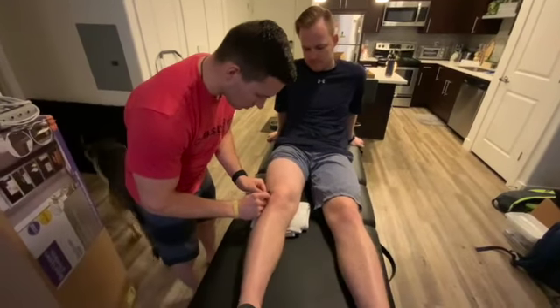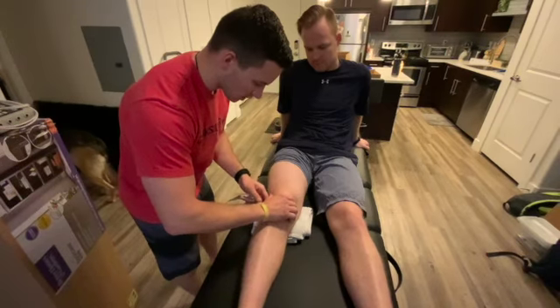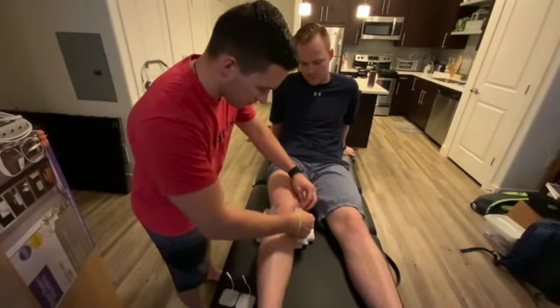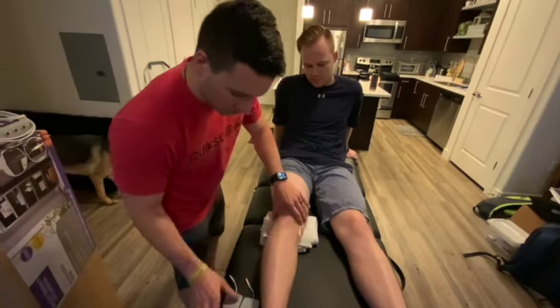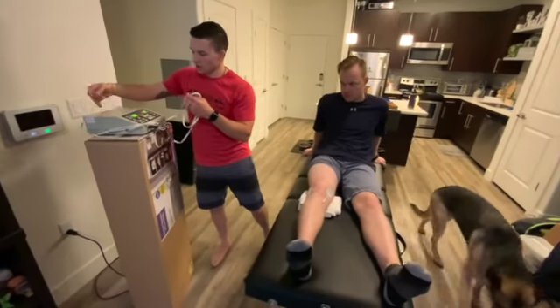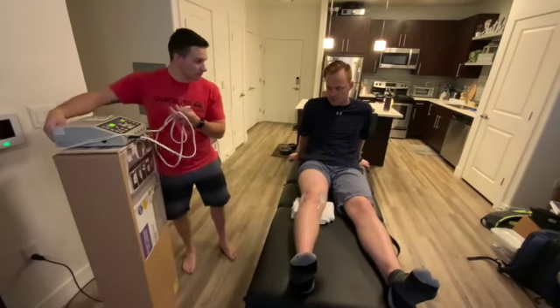I'm just going to go on either side of your knee, right on the joint line, to help with everything, okay? Just kind of get those through the muscles. And then we'll hook these little stim pads on here. Colton, have you had electrical stim before? No, it was the first time.